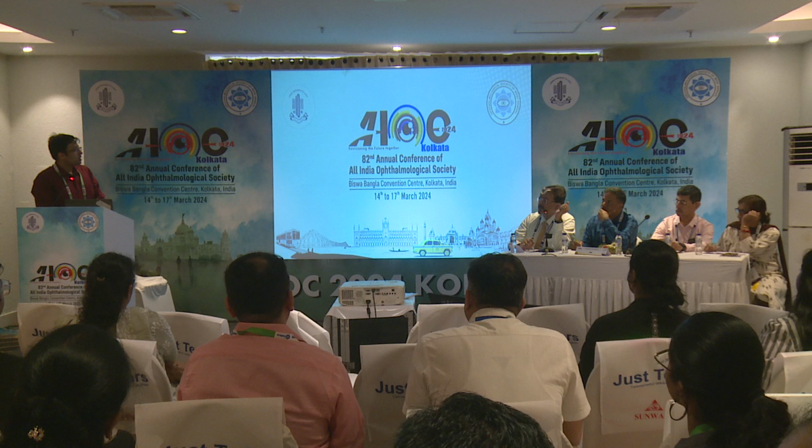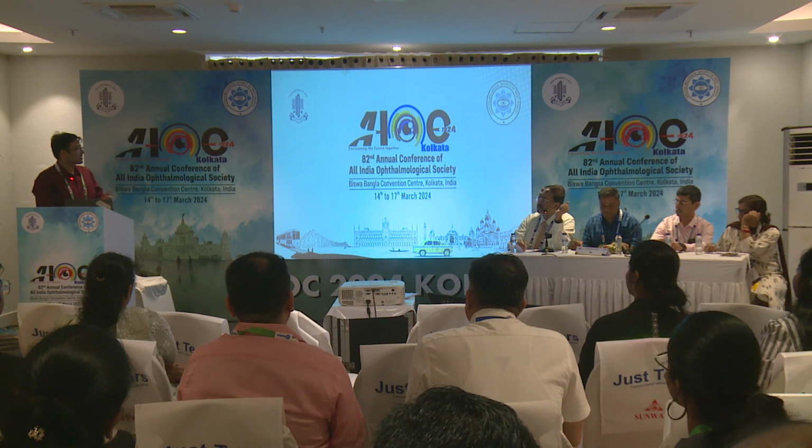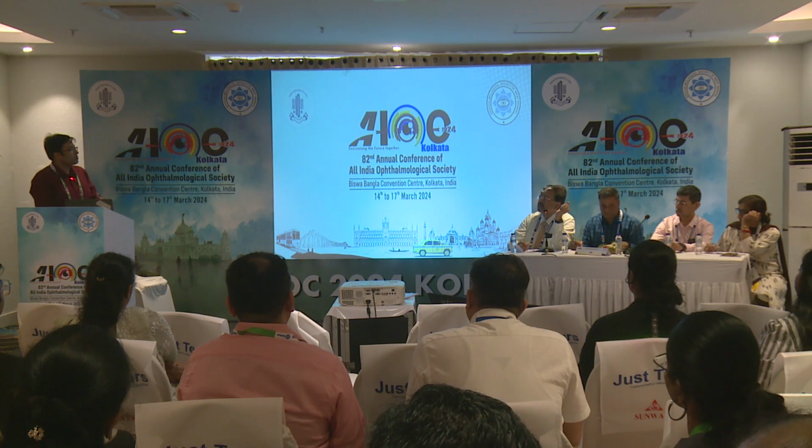Why did the smartphone take a little more time? The practice, sir, because even though we are more accustomed to indirect ophthalmoscopy, so that's the factor, sir. Because if we practice more with smartphones, then it will be shorter, sir, definitely.